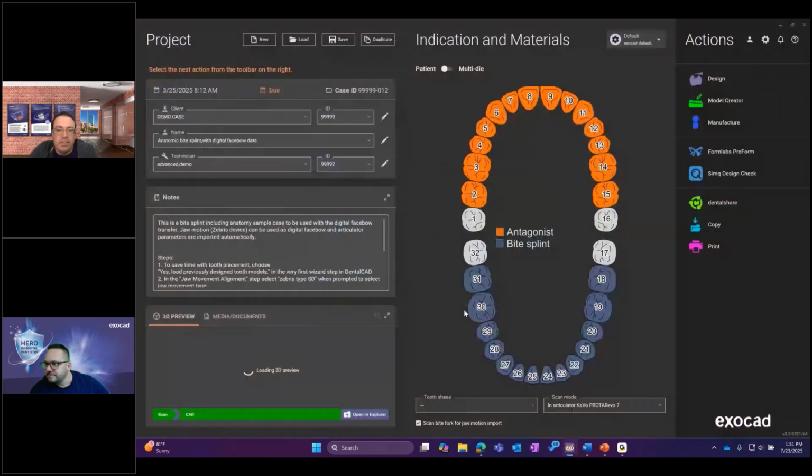Anything else that we should jump in with? We just got another question that came in asking about updates for partial CAD. As of right now, we don't have a public prototype distributing for partial CAD 3.3 Chemnitz, but similar to dental CAD, it's very far along with development. It seems very stable.